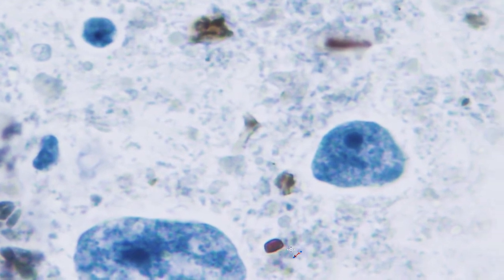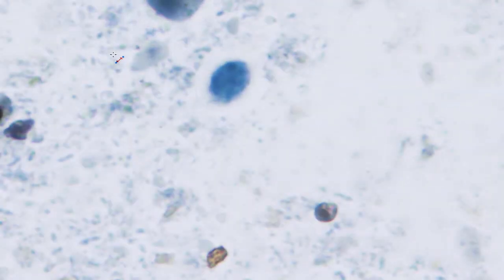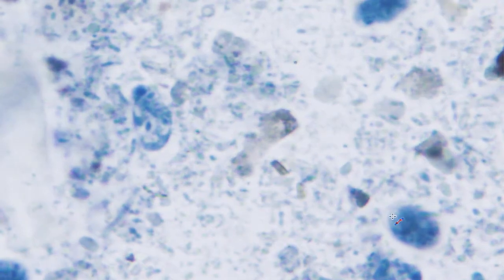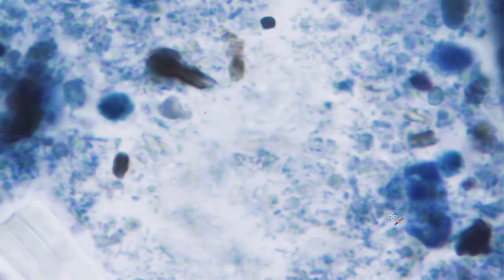These very large things here are trophozoites of Iodamoeba buetschlii. This is possibly a trophozoite of Endolimax nana, but buetschlii and nana are very hard to differentiate in trophozoite stage morphologically. Here is a cyst of Giardia. So just to show you that there are a lot of protozoa in this one person's feces, this is one individual, and this is what you will often see, particularly in people who have lived in very poor conditions such as refugee camps for an extended period of time. They will have multiple protozoa in their feces.